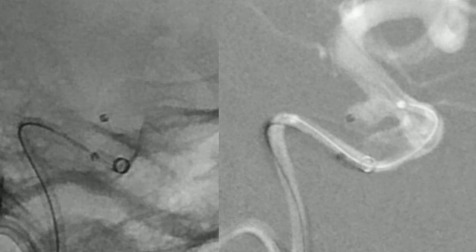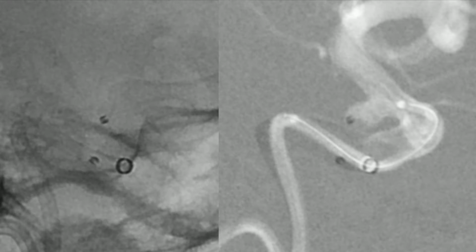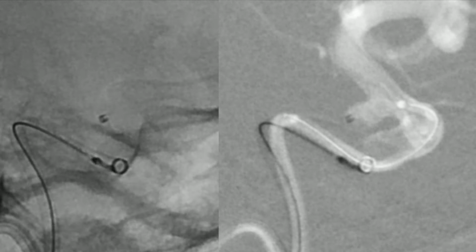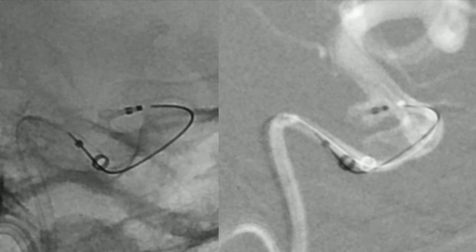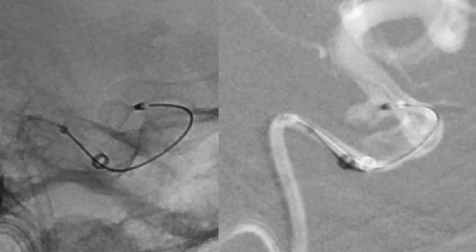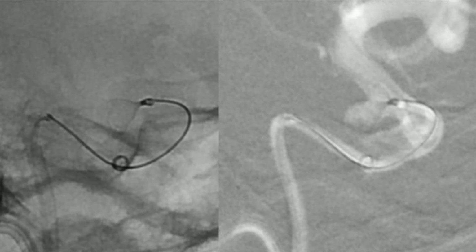We take out the 7 millimeter contour device and try it now with the 5 millimeter contour device. It's a little bit smaller, and we hope that it will open better than the previous one. And as you can see, it has opened very well and covered the neck of the aneurysm perfectly.